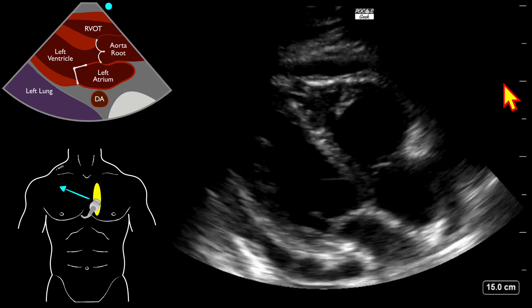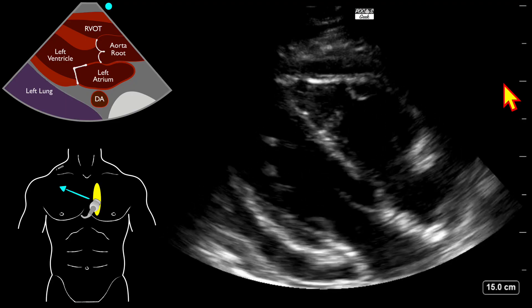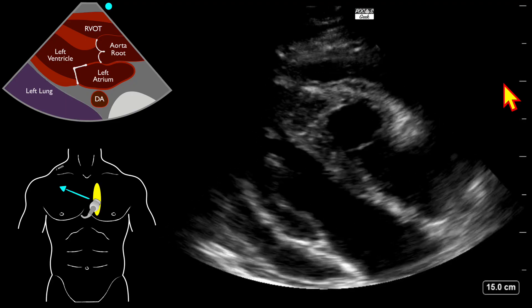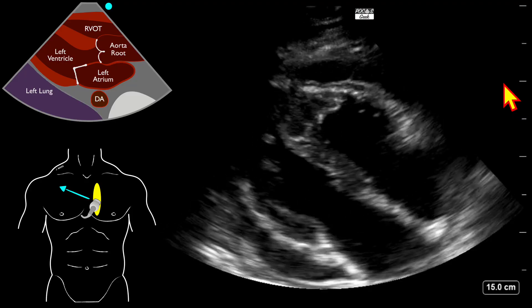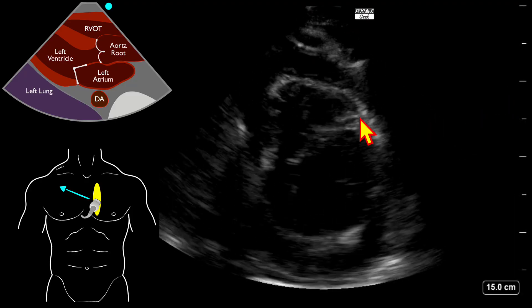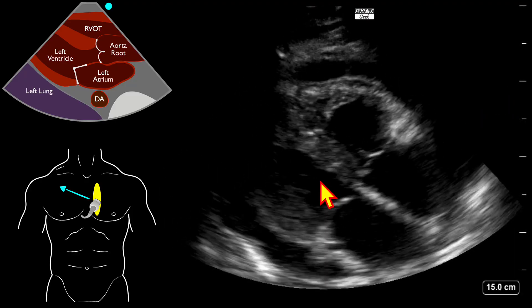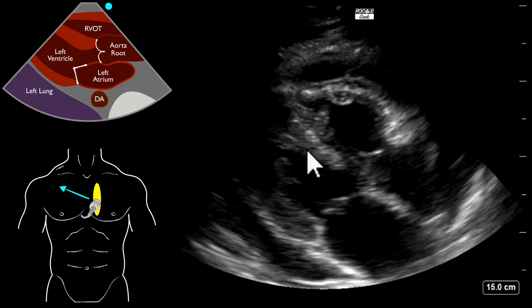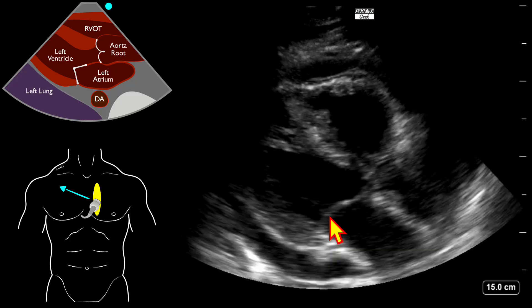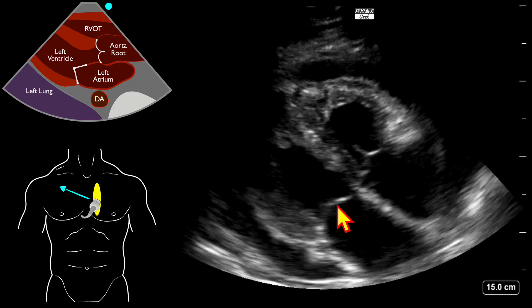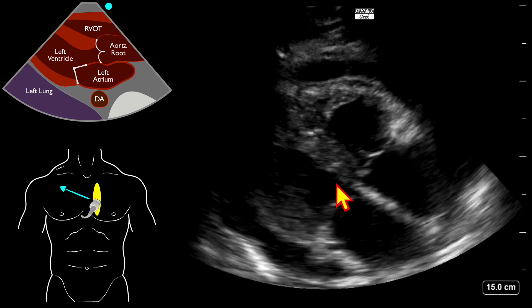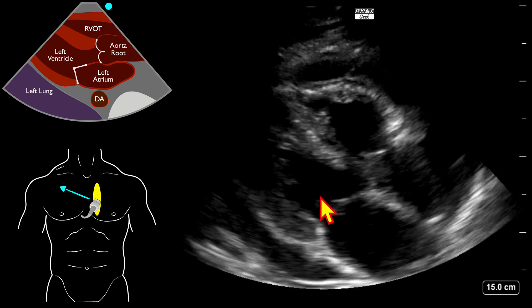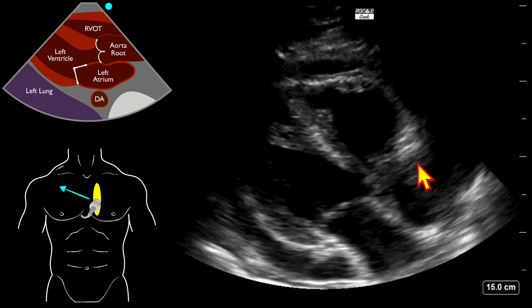If we get a second image—same thing, they archived two of them—we're not getting any more data than we did in the first one. Going back, we do see that the LV inner wall looks like it has good contraction. We can also see the mitral valve anterior leaflet is hitting the septal wall.